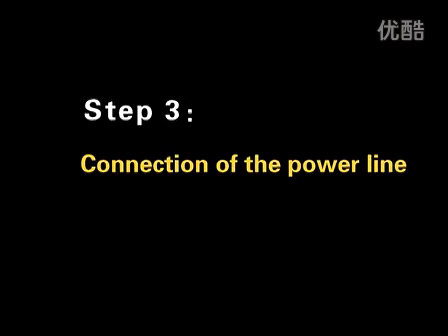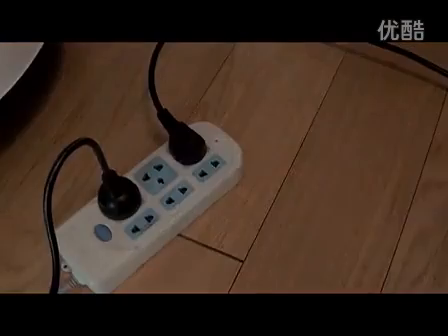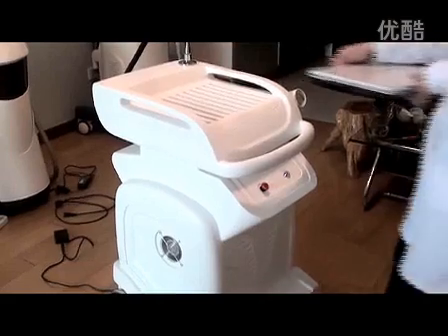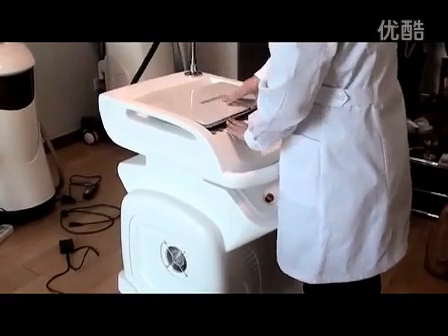Step 3: Connection of the power line. Plug the power line. Step 4: Connection between the machine and computer. Put the computer on the top of the machine and connect the USB data cable on the machine with the computer.